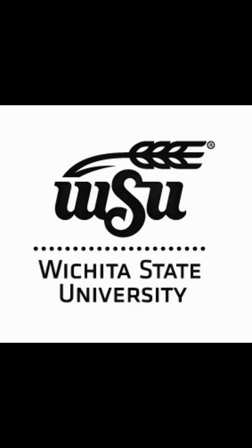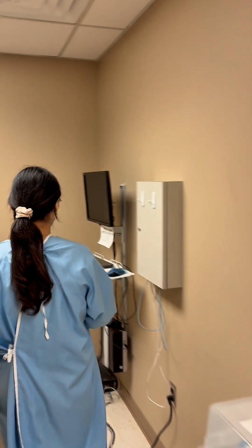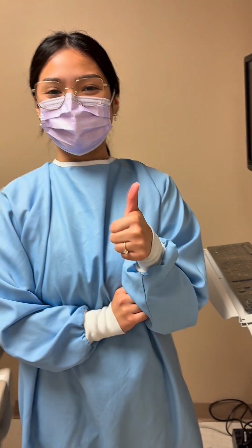This tutorial will demonstrate how to use the WSU panoramic machine. Begin by turning on the unit. Log into EagleSoft in Radiology Room G with your username and password. Be sure there is no sensor plugged into the CDR port.